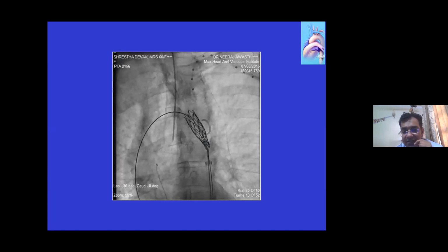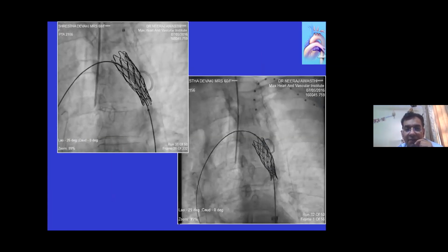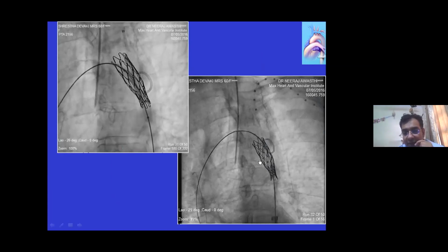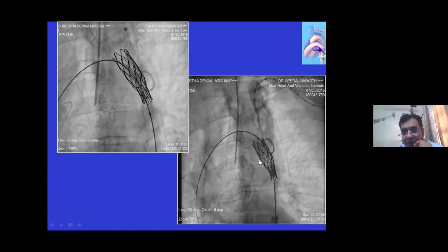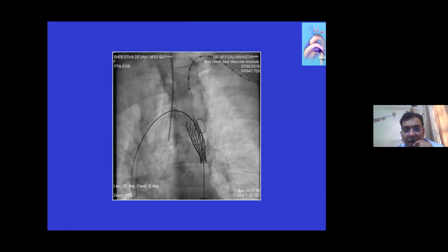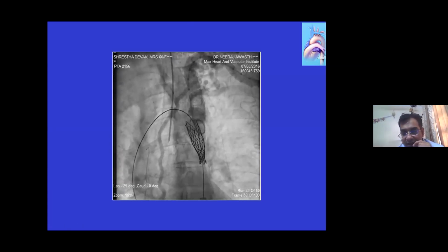Once it stabilized the stent, the intubation became easier with the balloon. So once we had stabilized the stent, it was intubated with a 10 millimeter Z-Med balloon and inflated. And once it was inflated over the balloon, we could easily redeploy it over the 10 millimeter balloon and pull it to the approximate position, like you see in this particular video.